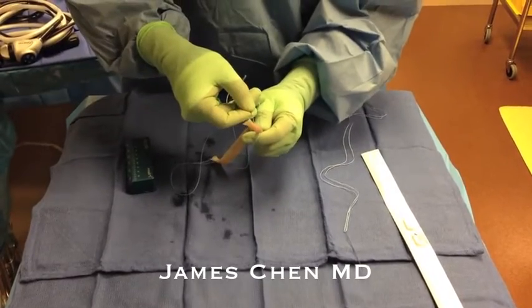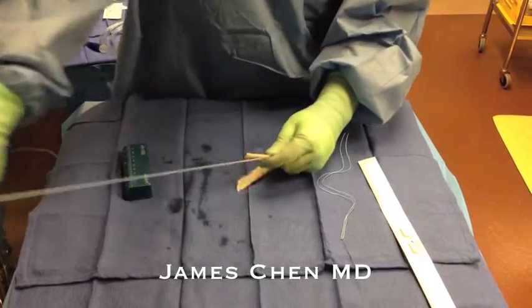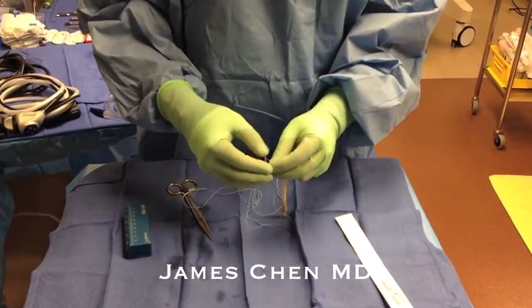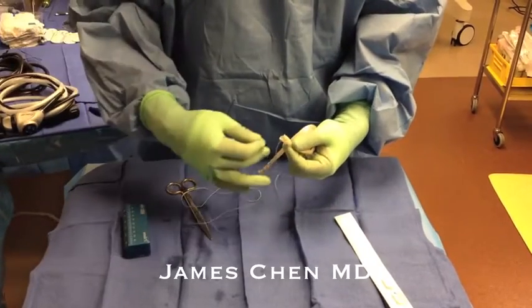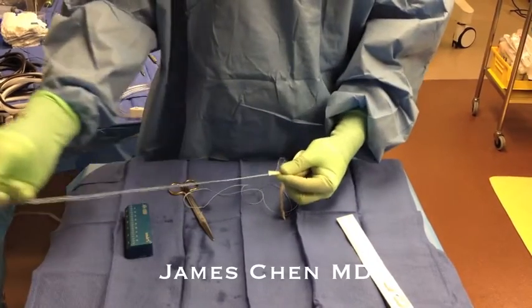I typically do not use a graft holder. I use a number two fiber loop on either end and whip stitch till the end, then cut the needle, and I do this to both ends.